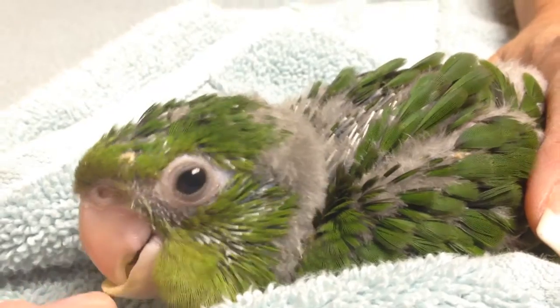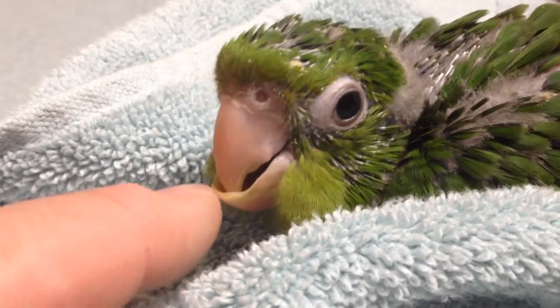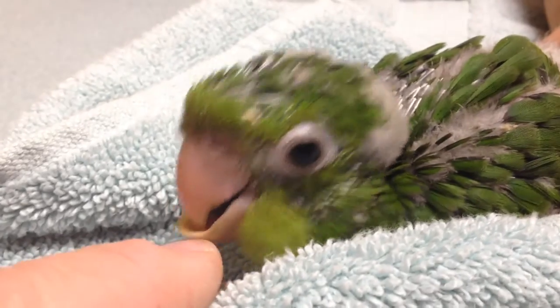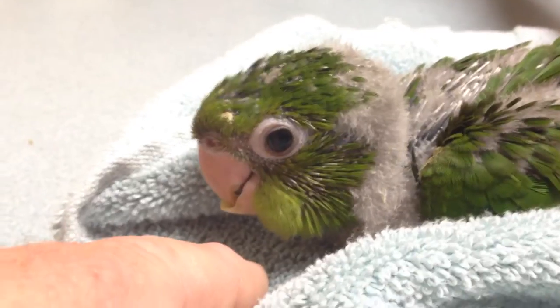But today I'm going to just trim this little point right there, and then we're going to start to tape the beak into place a little bit at a time. Mom has to be very, very careful because if this guy vomits with his beak taped like that, then that'd be bad news. So you cannot leave him taped if you are not there watching him constantly.